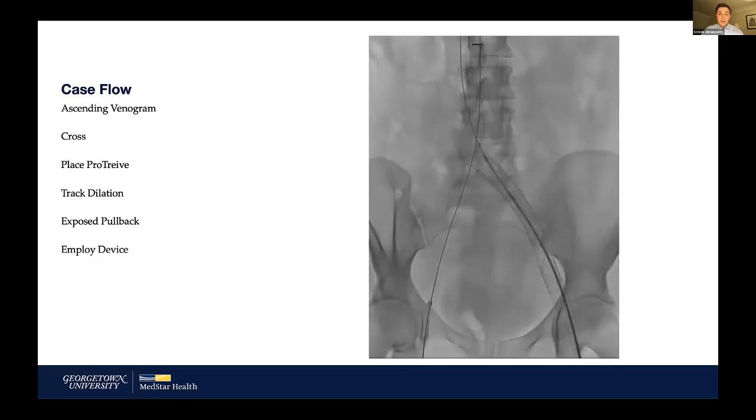The next step is to begin revving. As I said before, it's not those little cups chunking out material from the stent — it's really a shaving mechanism, almost a grinding or polishing mechanism. You don't crank it all the way up to 20 millimeters the first time. You go to the half mark and rev back and forth, proceeding from proximal to distal or distal to proximal. Then you can withdraw the device, inspect it as you resheath it, check for material on the coring element, put it back in the body, and go back at one notch higher diameter.